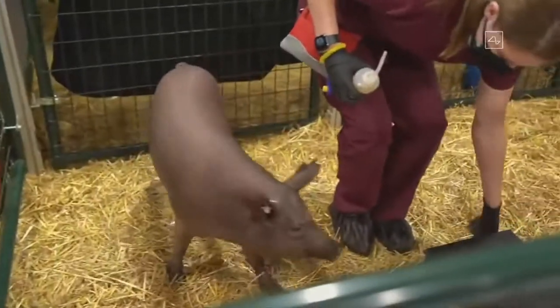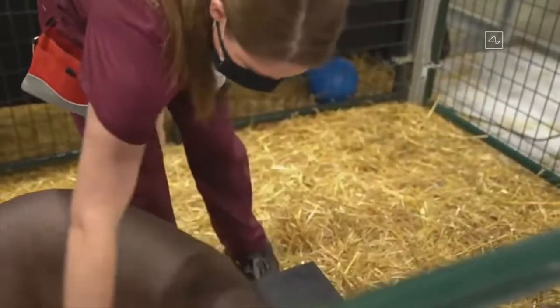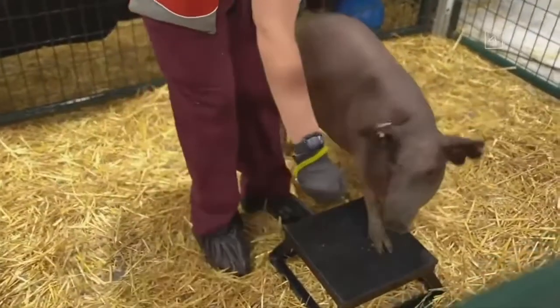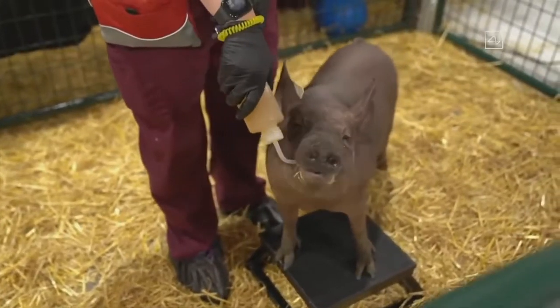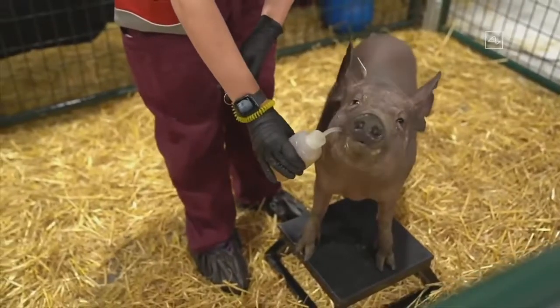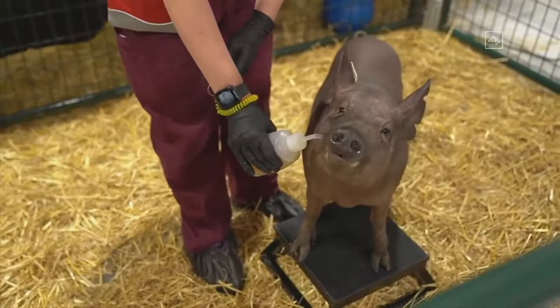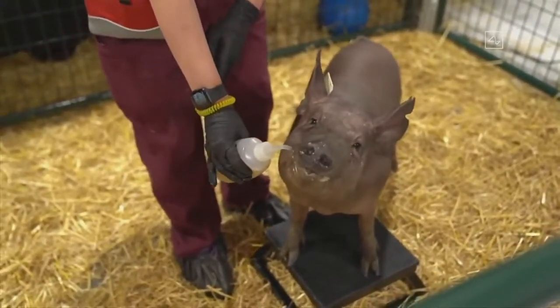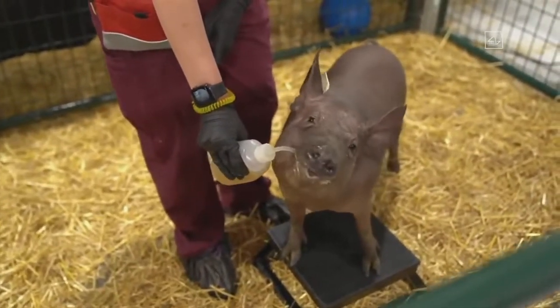Here's Dorothy. In the case of Dorothy, she used to have an implant, and then we removed the implant. This is a very important thing to demonstrate — reversibility. So if you have a Neuralink and then you decide you don't want it, or you want to get an upgrade, is it removed in such a way that you are still healthy and happy afterwards? What Dorothy illustrates is that you can put in the Neuralink, remove it, and be healthy, happy, and indistinguishable from a normal pig.